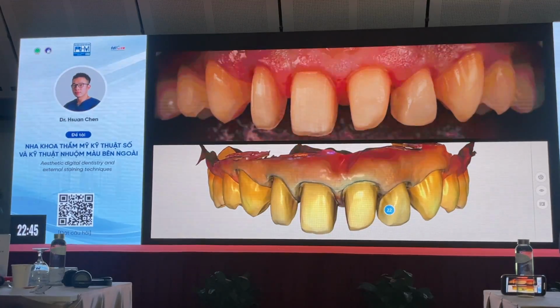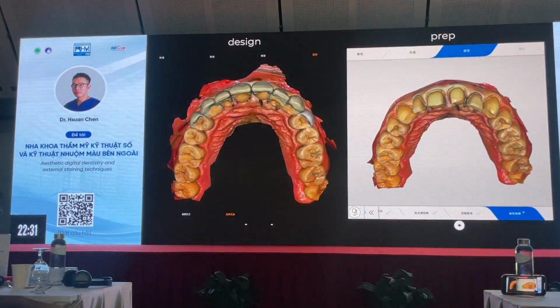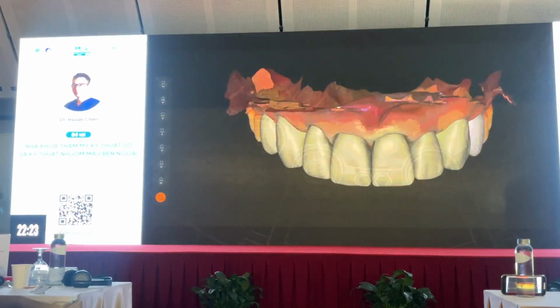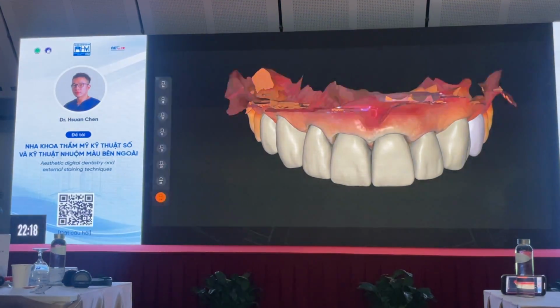So this is the preparation that we have for him. And on the bottom, we have a scan. And you can see here that the tooth number 22, again, the thickness will be just slightly more than the others. And this is the design in in-lab. Compared to the mock-up, it's the reference, so they look the same. And this is our design also in in-lab.